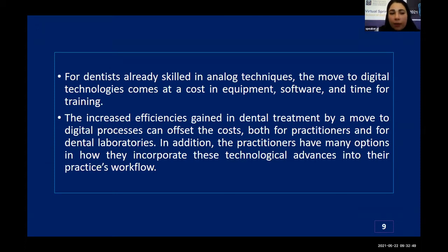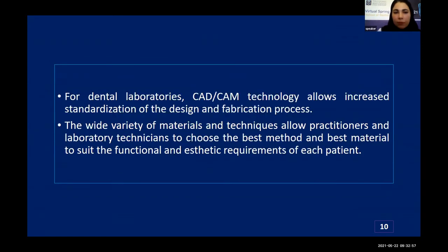On the other hand, the increased efficiency gained in dental treatment can offset the costs. For dental laboratories, digital technology allows increased standardization, and a wide variety of materials and techniques can be chosen and used.